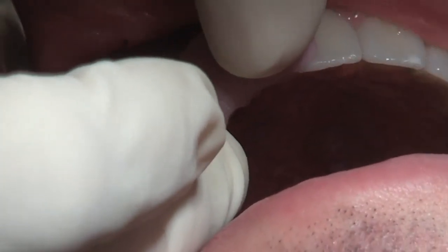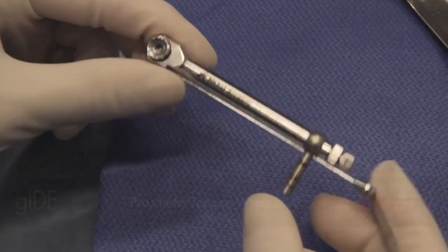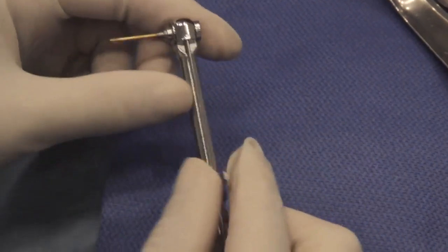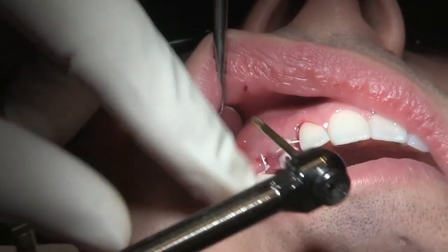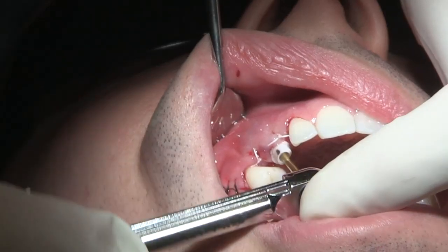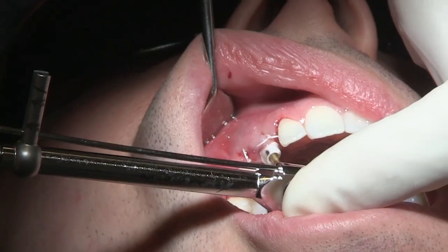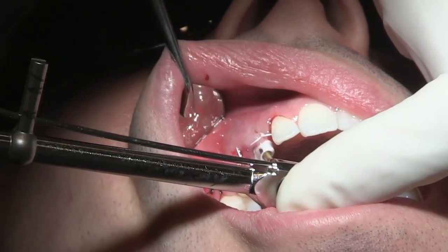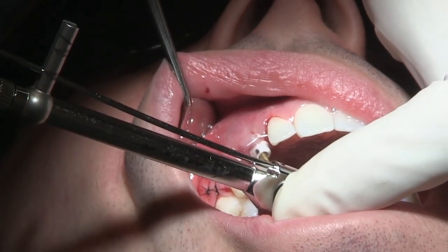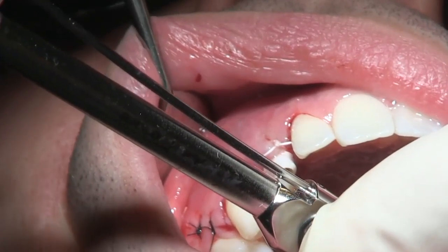Here you can see the application of a jig to ensure the proper angulation of the abutment. A prosthetic torque wrench is used to secure and stabilize the stock abutment with 15 Newton centimeters. This is a reduced torque due to the immediate function concept used in this patient. Once the implant is integrated, the final torque will be placed at 35 Newton centimeters for this zirconia abutment.